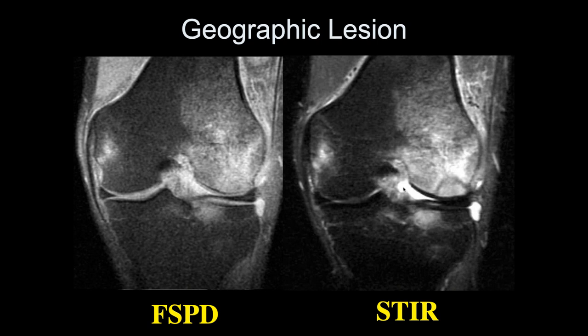There's always more force and more deformation at the time of injury than afterwards. After the injury, there's some reconstitution of the structure. In other words, it's compression and then decompression. Recompression. Thanks, John. So what you're looking at is a stable situation. Most of the damage that was done in terms of force and compression is not there anymore. So you have to think of this as future problems, more prominent than what the X-ray shows or the MRI shows.